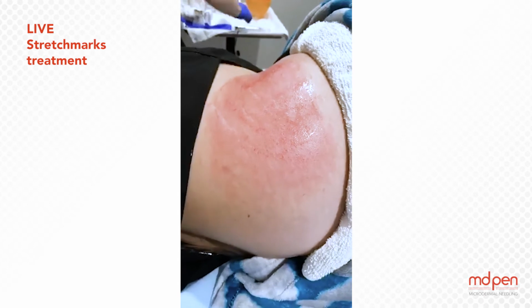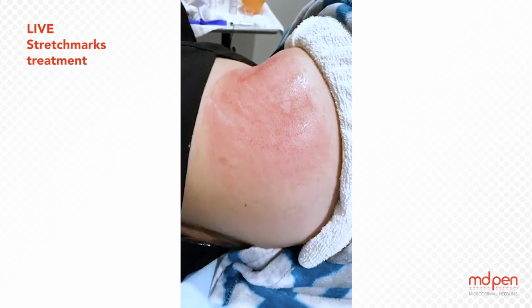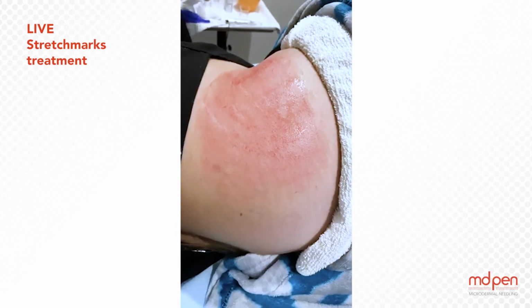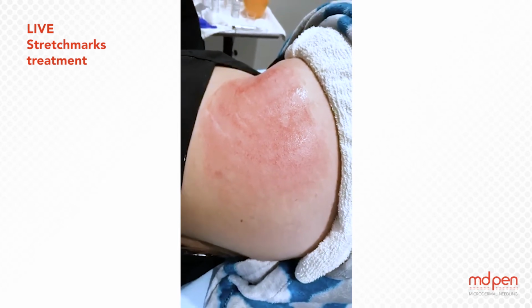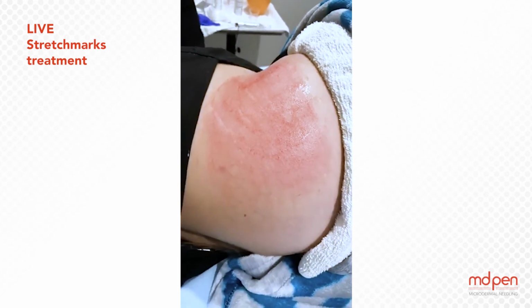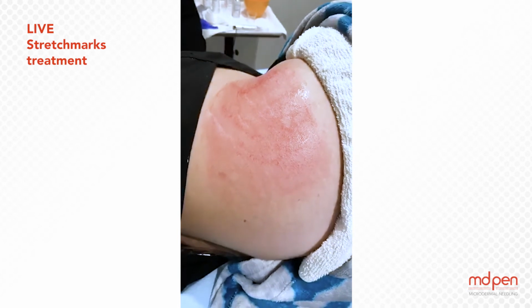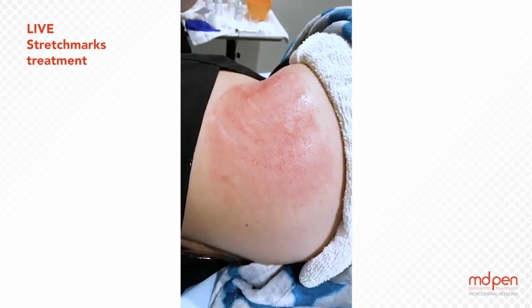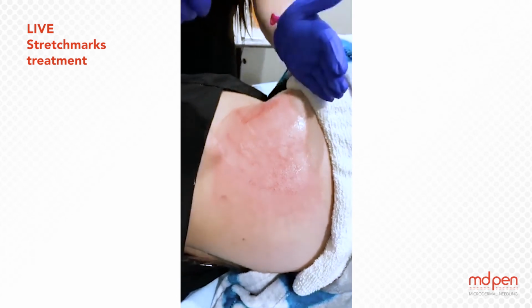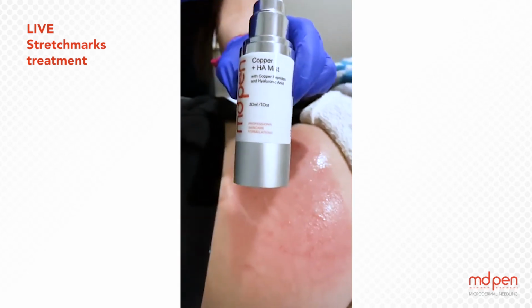She's looking good. I'm going to re-glove because I'm going to actually touch the copper mist spray. Love this spray. Great for inflammation, antimicrobial, feels good. She's probably starting to get that mild sunburnt feeling. That's what it looks like, guys.